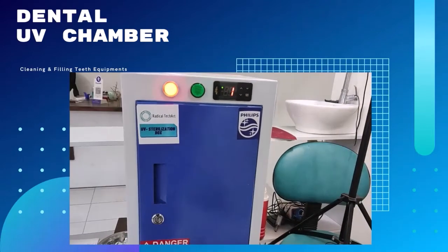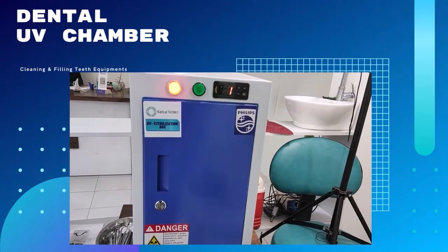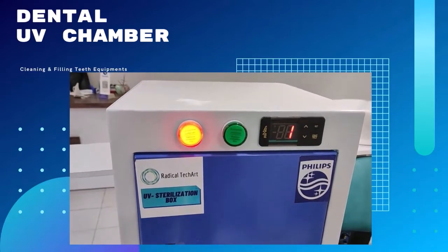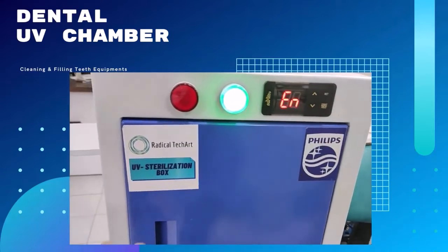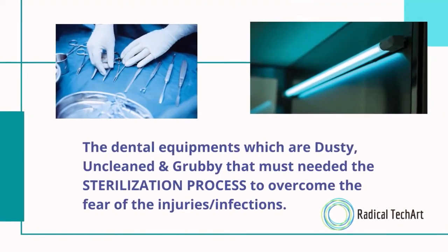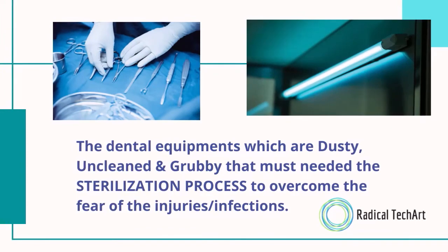Now I'm waiting for these instruments to be cleaned. When the timer is stopped after 3 minutes, it will automatically turn on the green light. Now one minute is left. The dental equipment which is dusty, uncleaned, and grubby must go through the sterilization process to overcome the fear of injuries and infections.